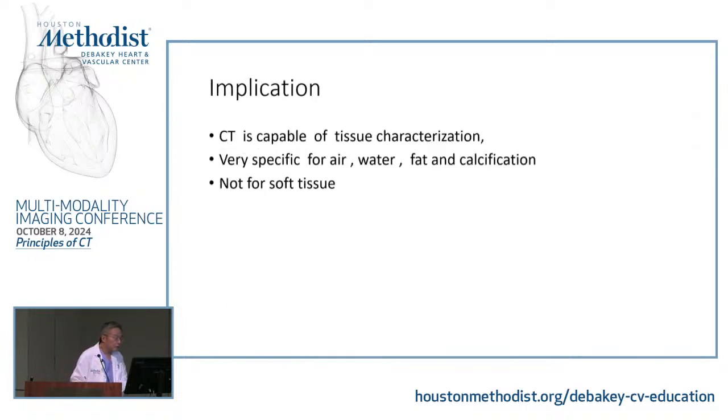Okay. So again, we talk about the X-ray tube. We send the X-ray through the patient. So the patient's tissue and body attenuate your photons.